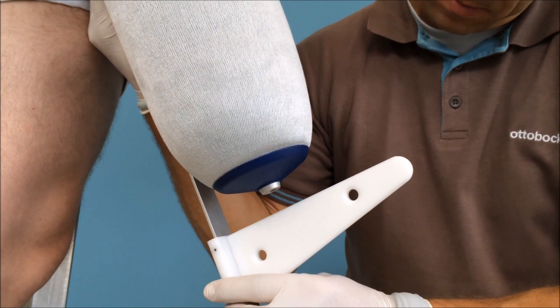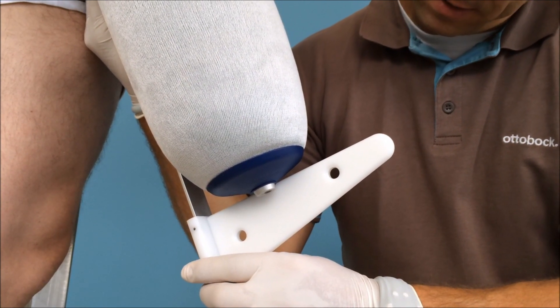If you're taking measurements with liners, the same basic tips and instructions apply as without. The main thing is to take the measurements directly on top of the liner. For new fittings it's helpful if you've already carried out compression therapy a week ahead of time and put the liner on the user 30 minutes before you take the measurements. The one difference is that we measure to the end of the liner cap when taking the length measurement.